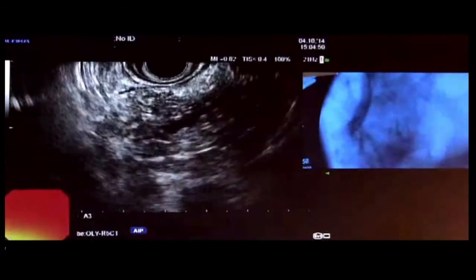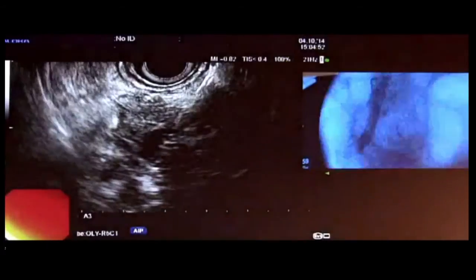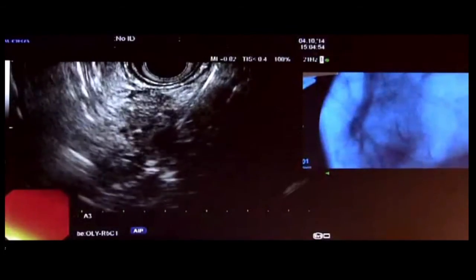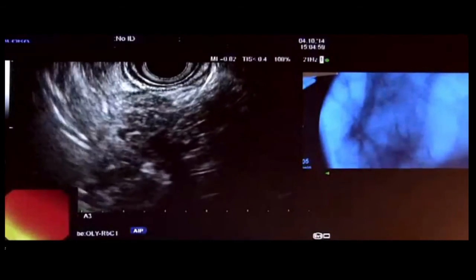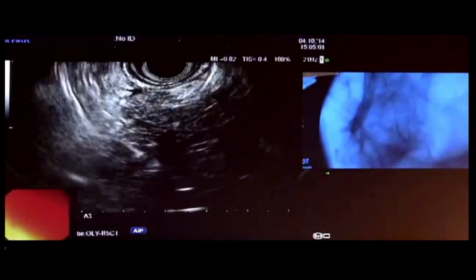You want me to keep trying to bring it? It'd be nice if you could pop through there. Should I bring it back a little bit? Yeah, a little. Bring it back a little more? Bring back the loop and try to train it. Pull back, pull back. All right, and as you advance the wire a little bit forward, it's one to one. I'm going to lock the thumb screw.